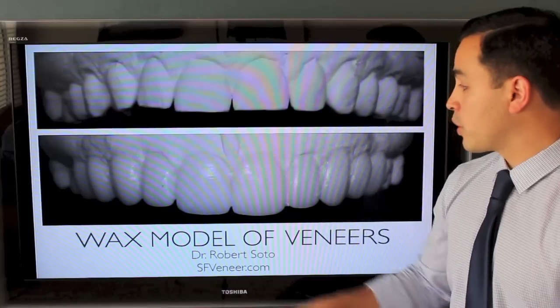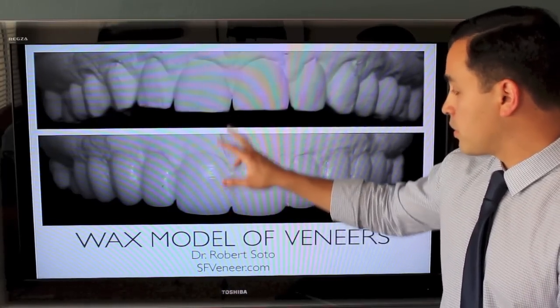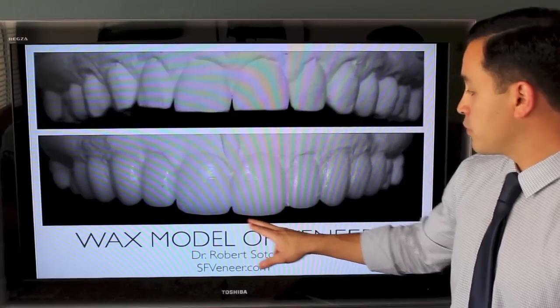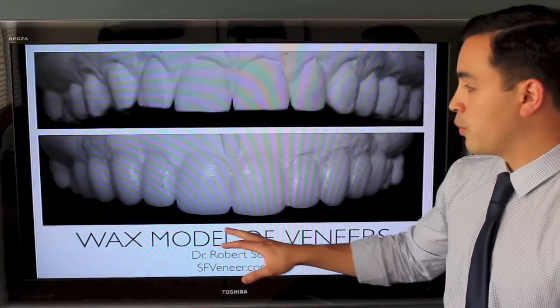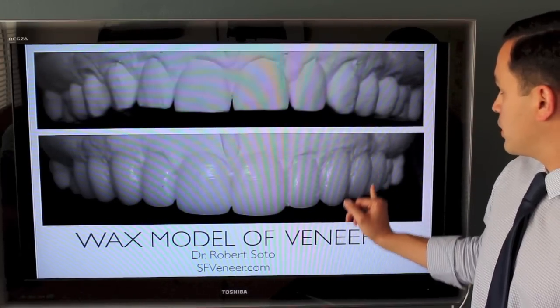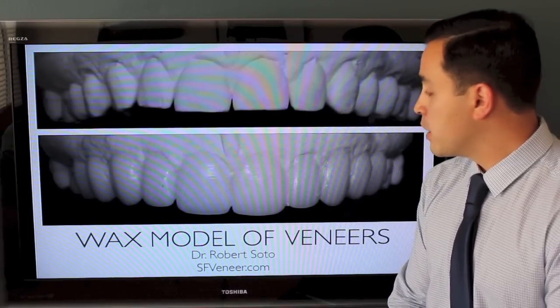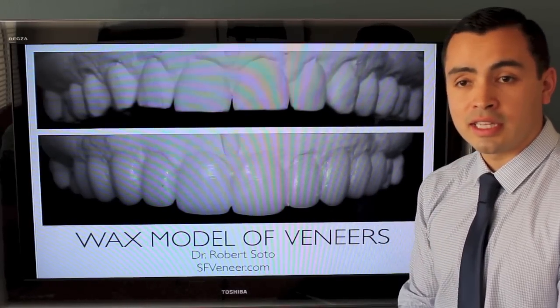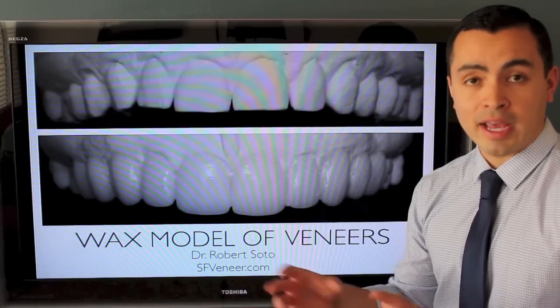We give that information to the laboratory and they give us this model back. We can see that the teeth are obviously longer and have different shapes to them. We ended up going with eight teeth here, starting back at the premolar — we wanted these teeth to be perfectly parallel with one another. The patient can look at this, I can look at this, and we're going to use this as a blueprint for our temporary and final veneers.